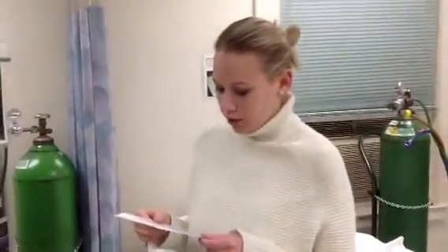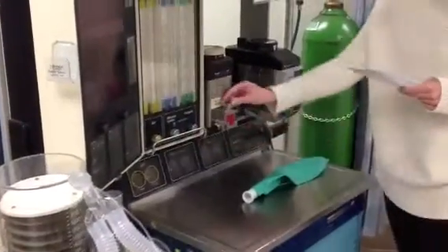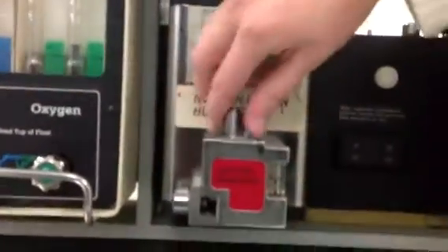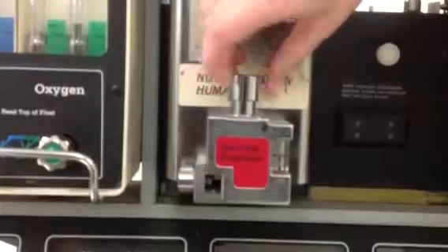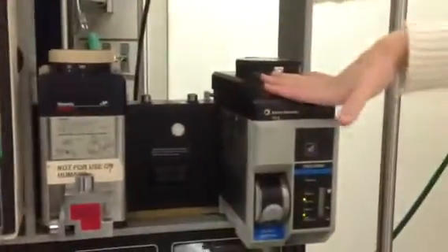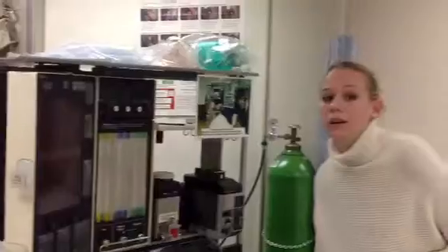The low pressure check is you go to the flow control valves, make sure they're all off, then go to your vaporizers, make sure they're in the off position, and check their fill levels. The fill level is in between the two arrows, and make sure the filler cap is tightened all the way to the right. Then you are going to perform a leak check.